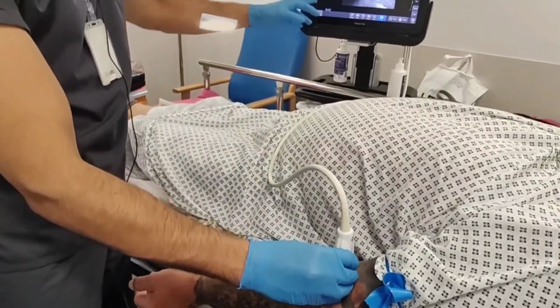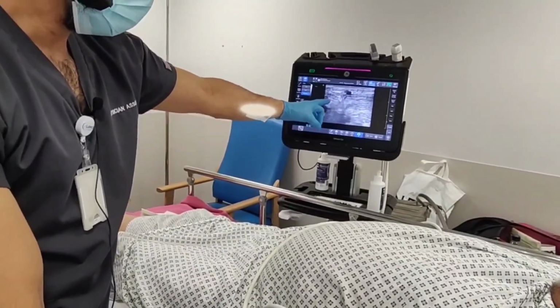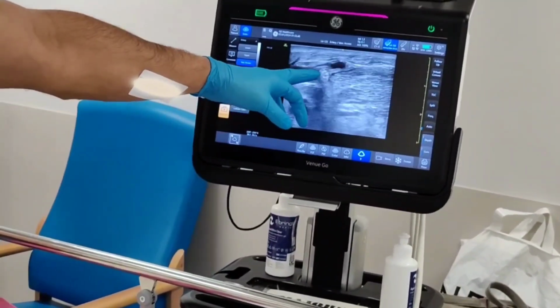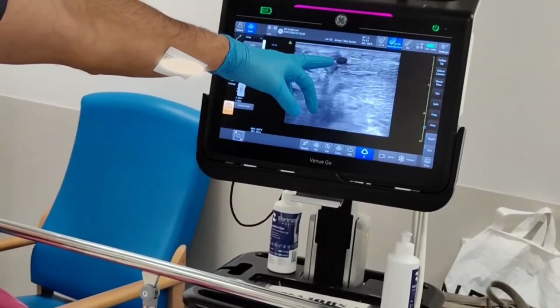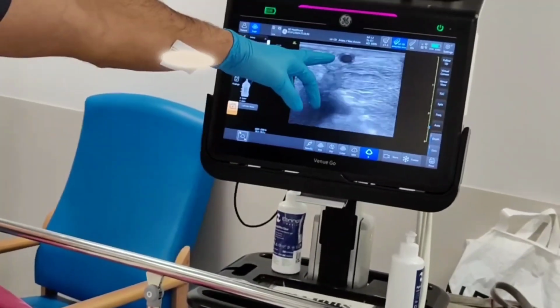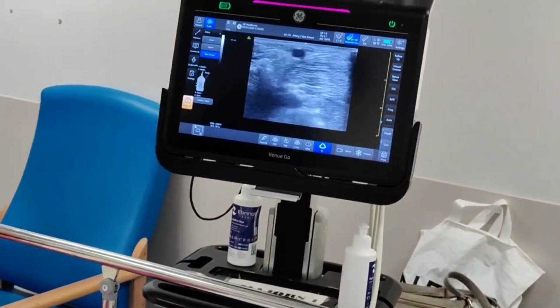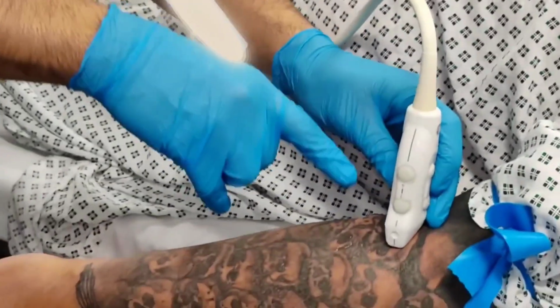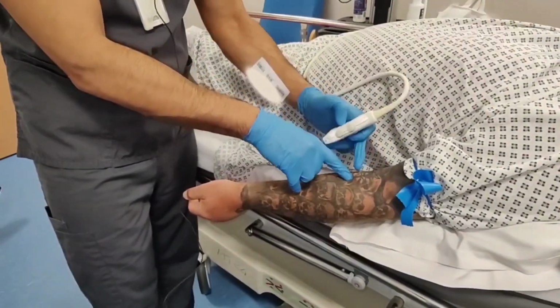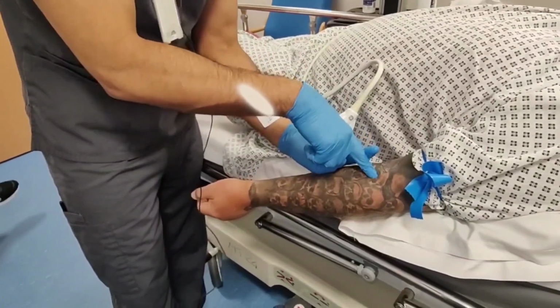The next thing to consider is at what point will I enter the actual skin. So personally, now we're going to go up and down on this, because that's going deeper and more superficial. So as I've come further distal, that's deep, and as I come more proximal, you can see that becomes more superficial, albeit marginal, but it's important. And then once I pass the peak point, it goes deep again. And so when I go in, come back on the arm, when I go in with my cannula, if I enter at that point where it's deep and it's becoming superficial, the blood vessel is running in that direction. I'm going to go in that direction. So I'm actually going to intersect like that.